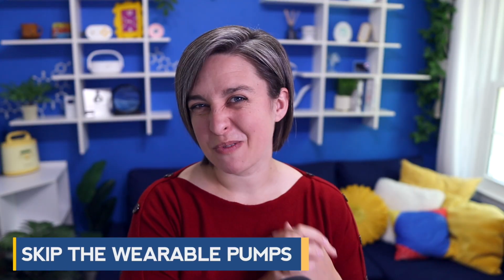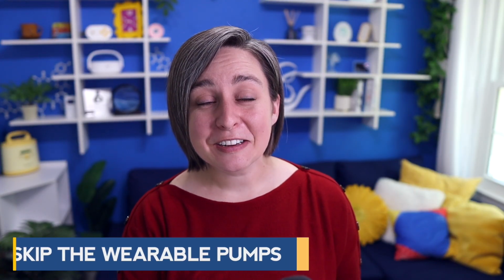Okay, we're going to start off with the bad news first. My first piece of advice for you is to skip the wearable pumps. And I hate to say this to you because wearable pumps are great. They really give us that convenience factor. They just seem like they solve all the world's problems, but they are tricky to use. Especially if you're not already comfortable with pumping and the aspects that go into that, flange-sizing and pumping techniques and understanding settings, and being really comfortable with your milk output, your milk storage capacity, what your supply is doing. We really have to have all of these things well figured out before we start dealing with wearable pumps.